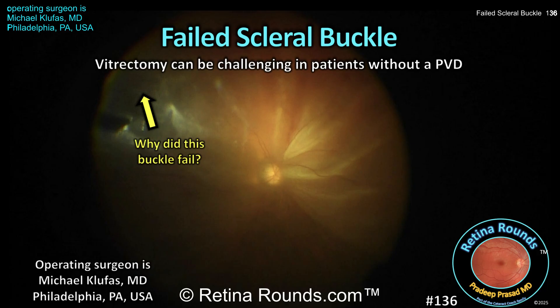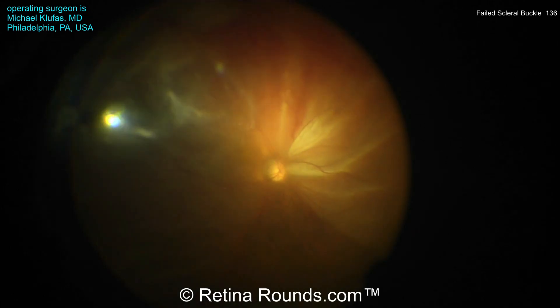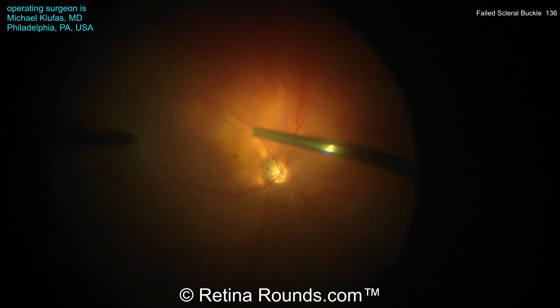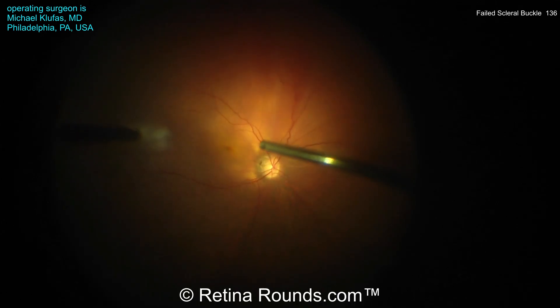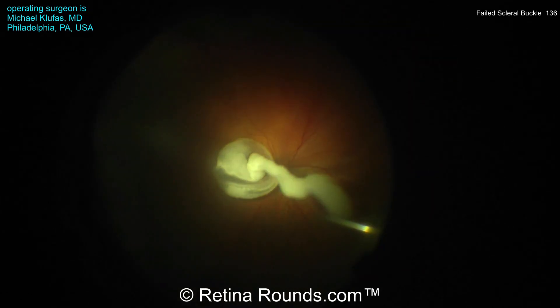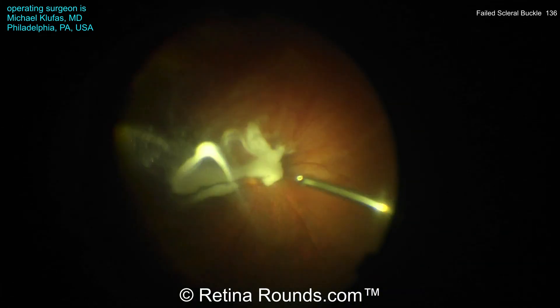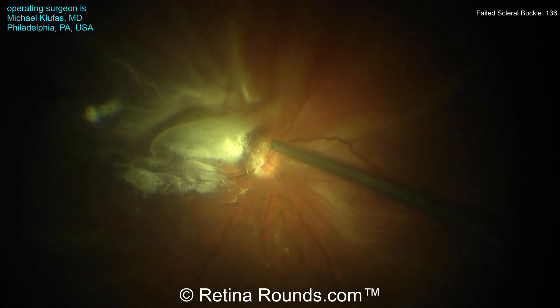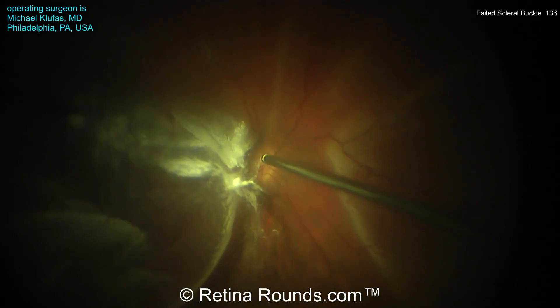Thank you, Dr. Klufas, for sharing this case. You can see here that Dr. Klufas has opted to perform a vitrectomy for this patient who has a failed scleral buckle. Initially, you can see that there is some vitreous haze, although not really any vitreous clumps or any other signs of PVR. Now the core vitrectomy is performed, and some triamcinolone is placed to identify the posterior hyaloid. And you can see here Dr. Klufas is inducing the PVD.